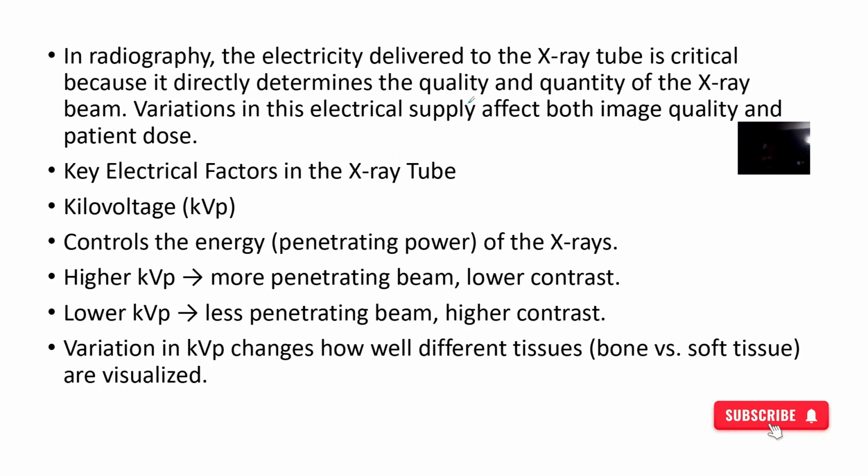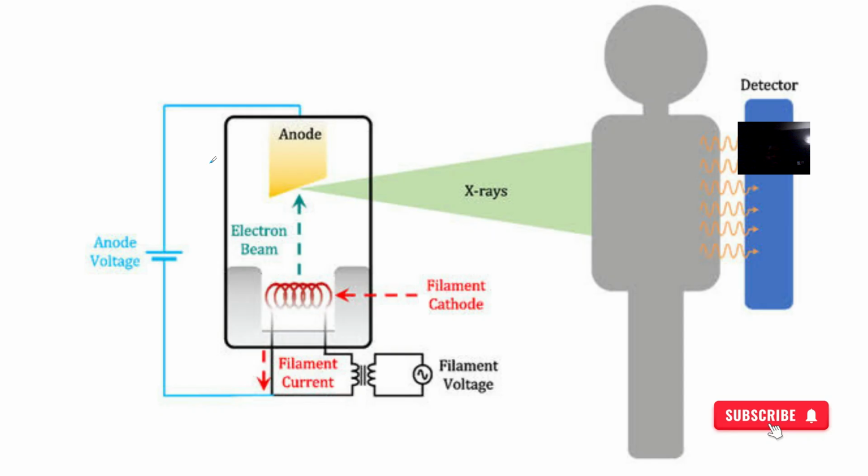Do you understand? It determines the quality and quantity of the X-ray that will be hitting the patient. Thereby, it will also affect the image quality and how much of the X-rays is actually hitting the patient.